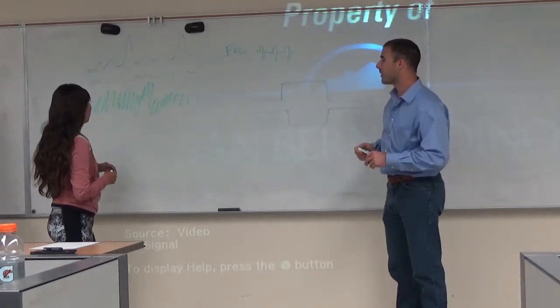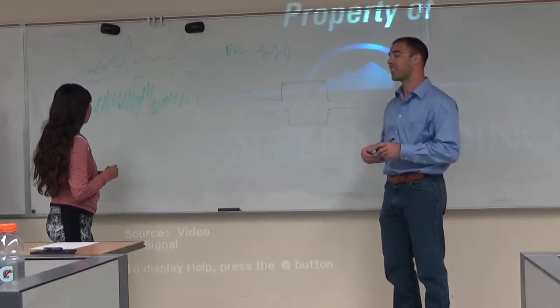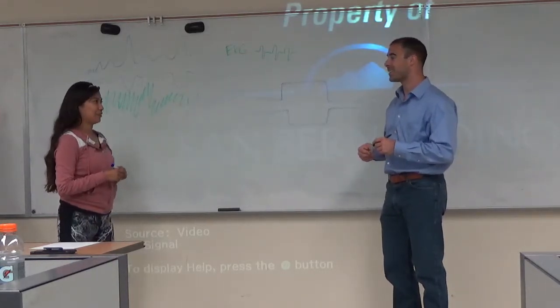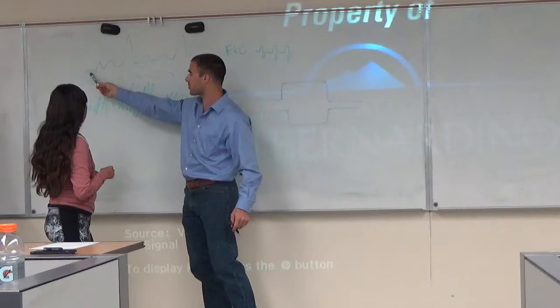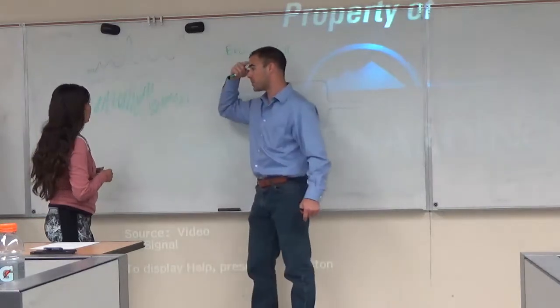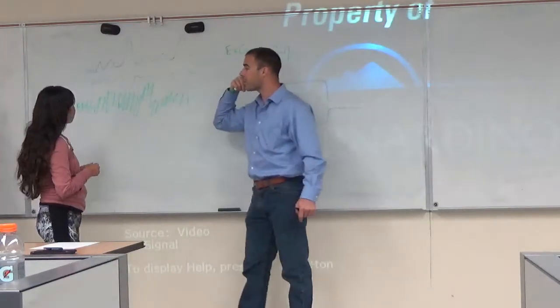Okay. Any guess on what E means in our class about electrical things? Yeah, so it's an electro-ocular gram. Instead of EEG, it's an electrical measurement of the ocular activity. So it's electrical. And the V means that's the vertical one, the one vertically above the eye. The L means it's lower.